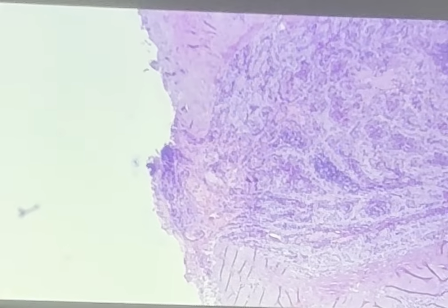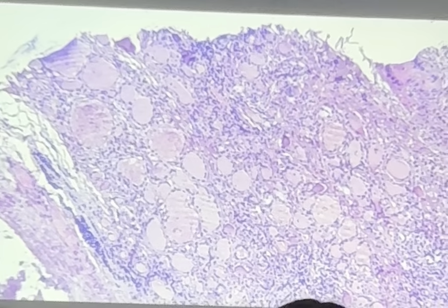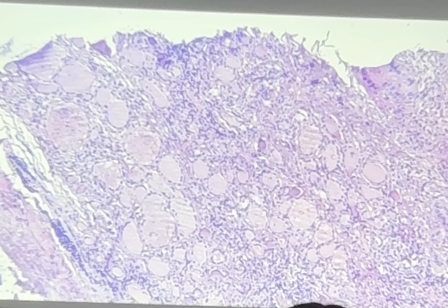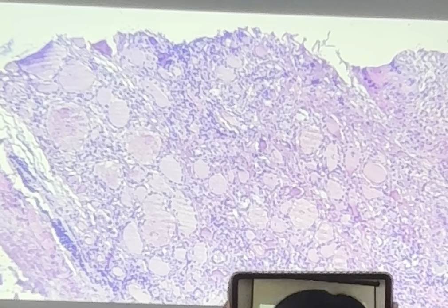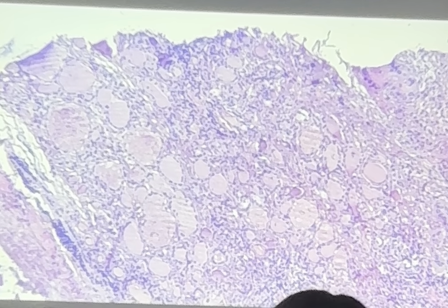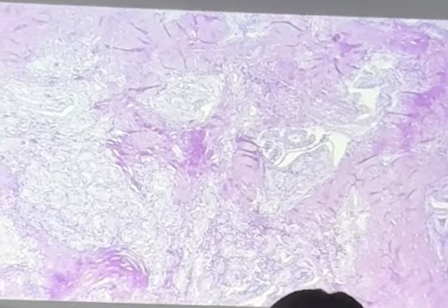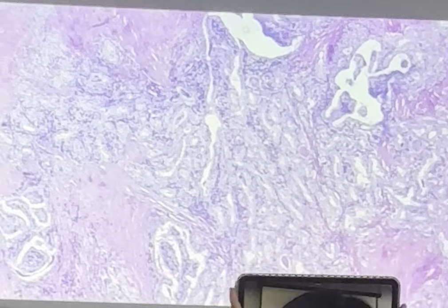Okay, so here, I'll show you what's left of the normal tissue first. This is all that's left of the normal tissue. What organ is this? Thyroid. Although there's a lot of inflammation. You see the small cells surrounding the thyrocytes, these little dots, those are just lymphocytes. So there's a lot of lymphocytes. But the problem isn't the lymphocytes. The problem goes here in this area. Okay? These are not lymphoid follicles, right? They're not.